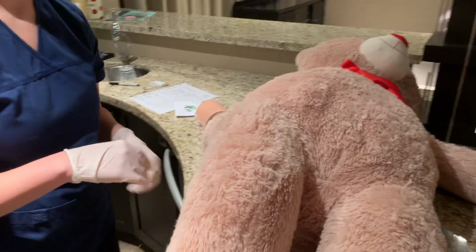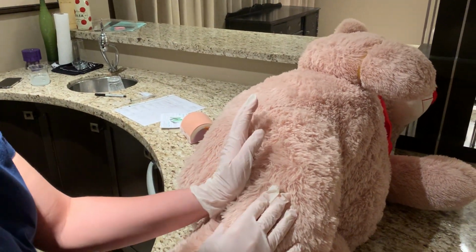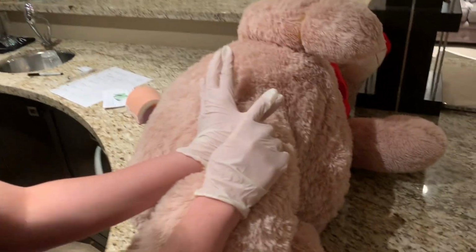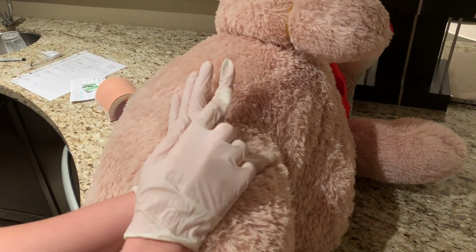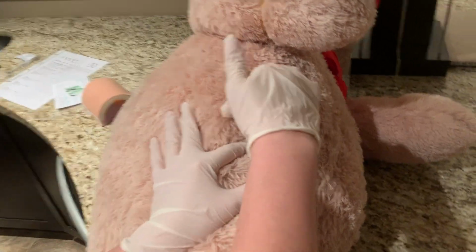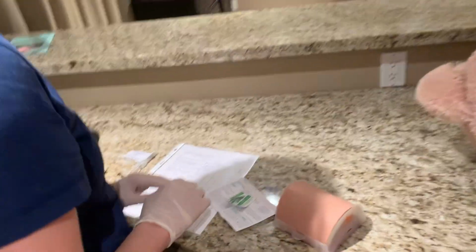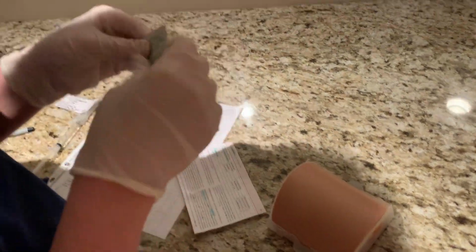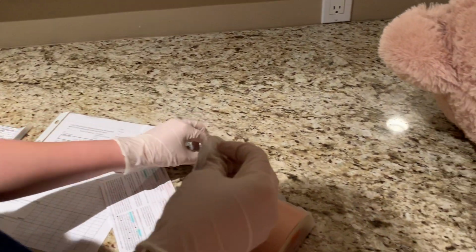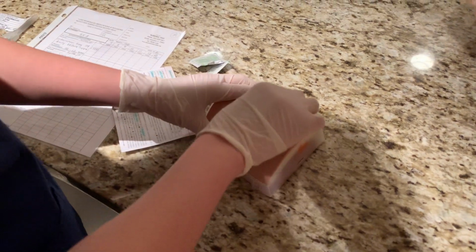I've chosen the ventrogluteal, so on a person, the heel of my hand would be at the greater trochanter. My thumb would be pointing towards the groin, my first finger towards the iliac spine, and my middle finger towards the iliac crest. And then I would be injecting in the middle. I chose this site because it's an intramuscular site, as well as it's good for high volume injections. After I'm done that, I will take my alcohol swab and clean the site for 30 seconds, and then I'm going to let it dry.